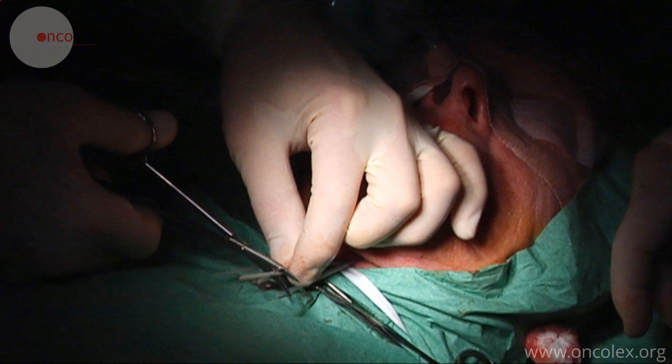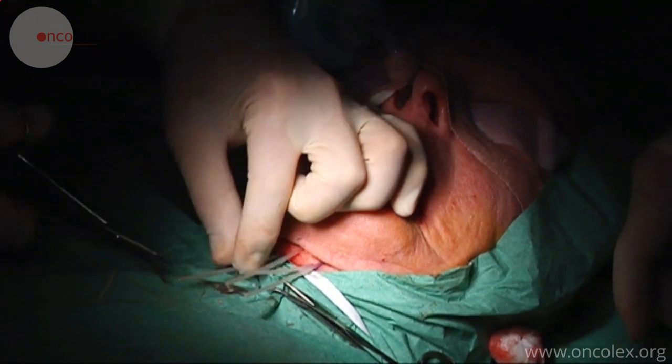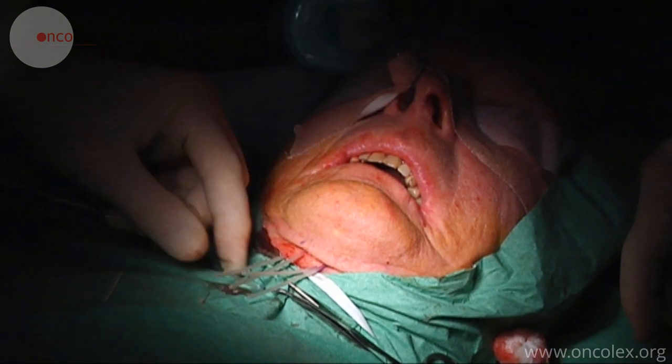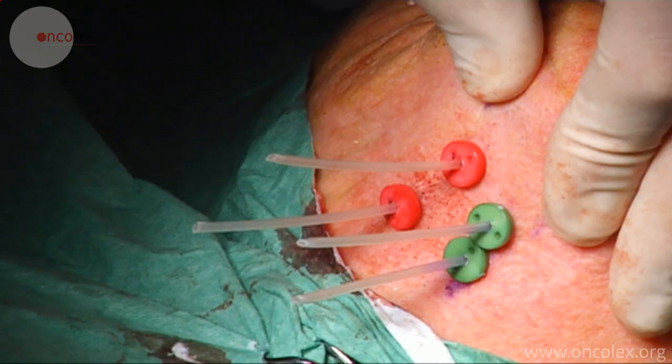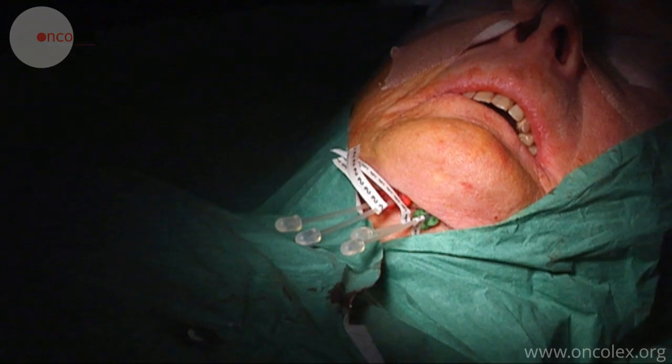The catheters are cut to the right length and attached under the chin with buttons. Finally, the catheters are marked with numbers and plugged. The patient is now ready for brachytherapy.